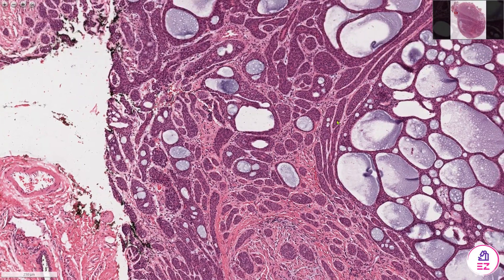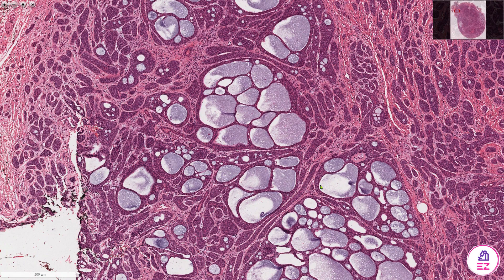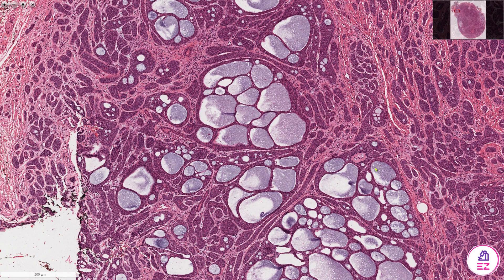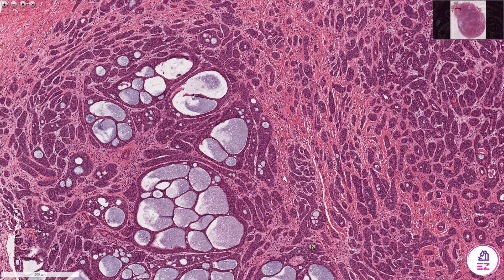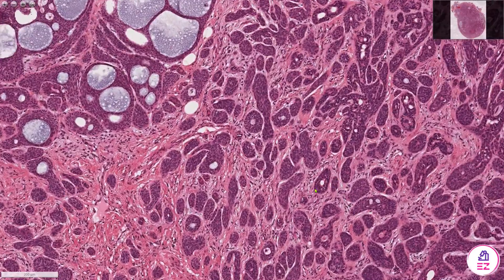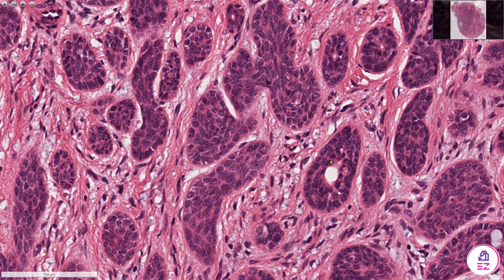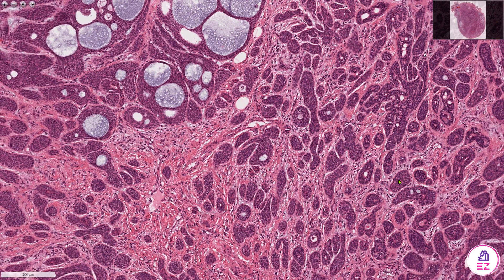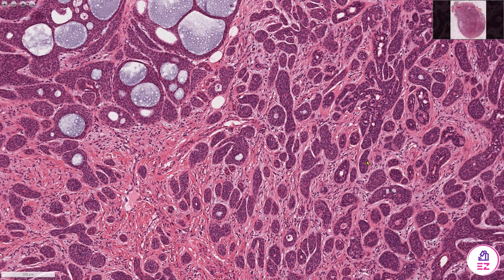These tumours are biphasic tumours because they are composed of epithelial and myoepithelial cells. Low molecular weight markers like CAM 5.2 typically highlight the inner luminal cells, whereas the myoepithelial cells would be positive for things such as P63, P40, sometimes SMA and S100.